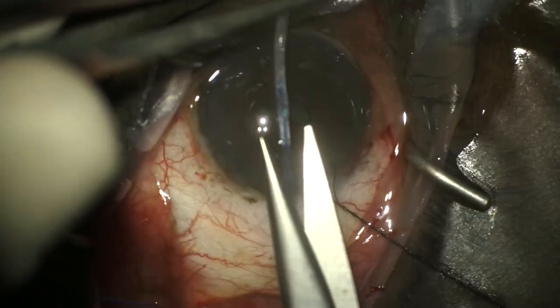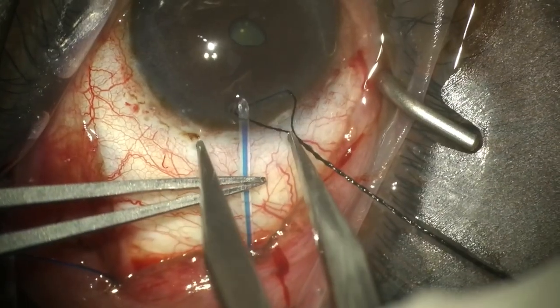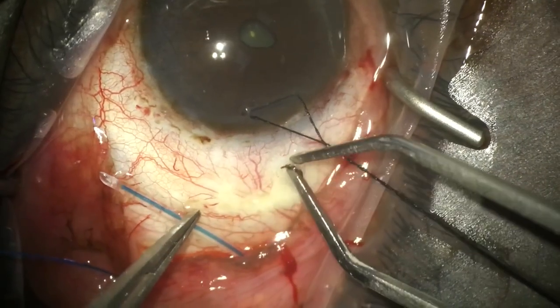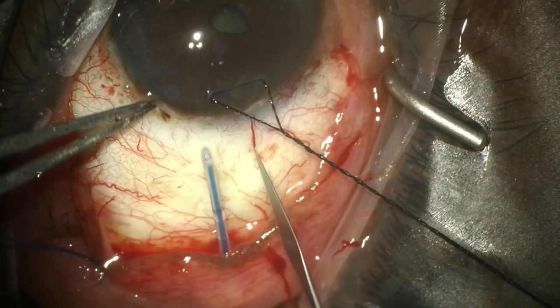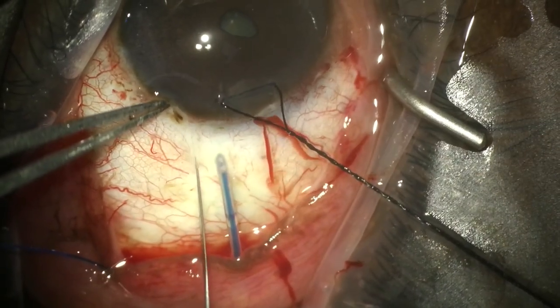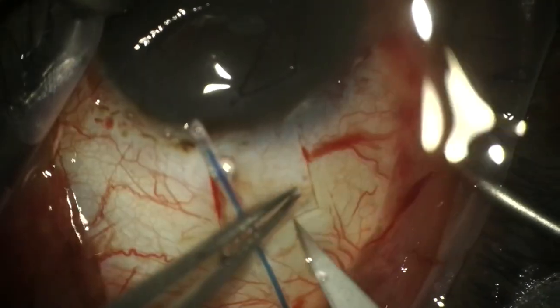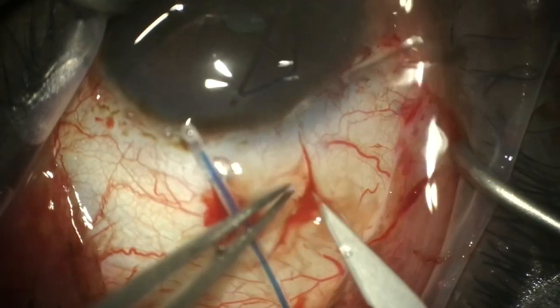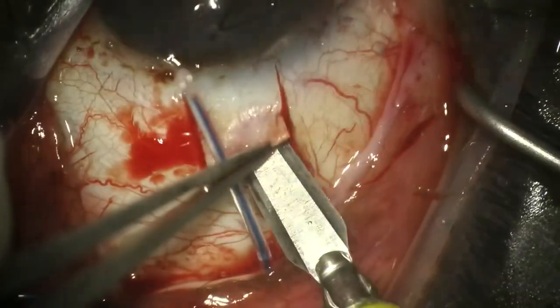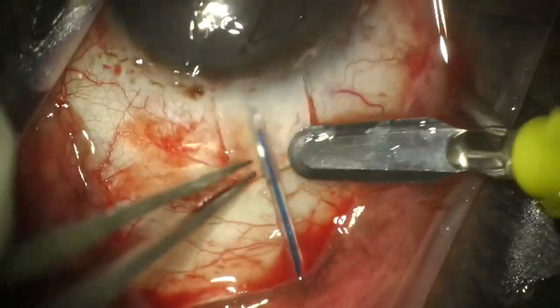We trim the tube to the appropriate length with a bevel up. As we do not have access to any Tutoplast or donor sclera, we create a flap from the patient's native sclera — a 5 by 5 millimeter flap using a 15-degree blade. Once we've scored the flap, we dissect a half-thickness scleral flap using a crescent blade to keep the thickness accurate.